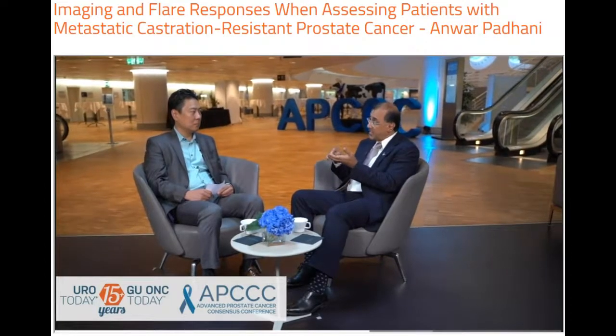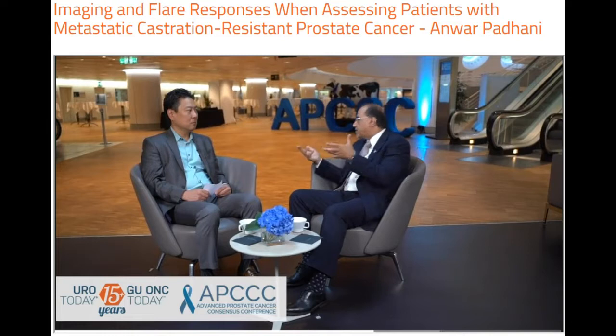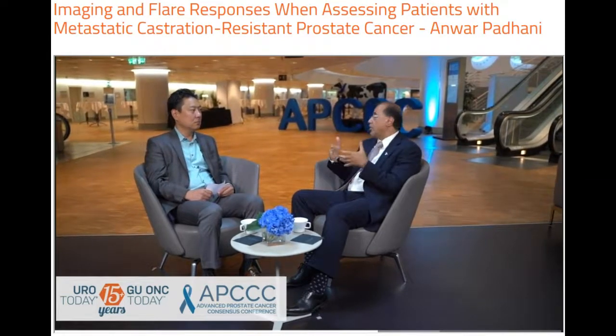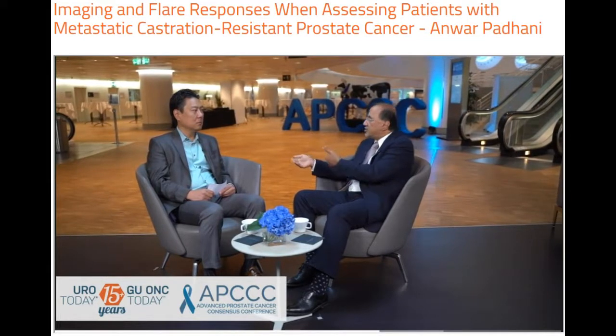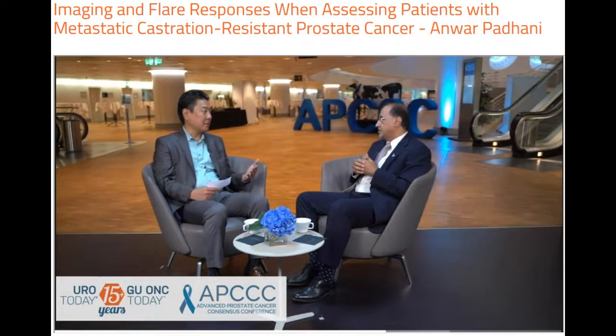So you can see how by looking at the tumor cells themselves rather than the matrix response, you actually get a better readout. And that's why we are advocating these next generation technologies for next generation imaging trials or clinical trials. So how about thoughts on PSMA PET-CT in some of these trials?